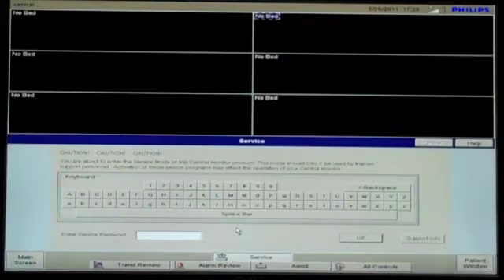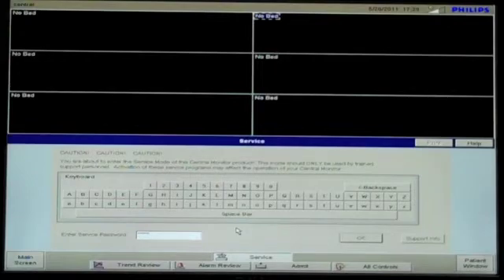Enter the password, M3150, the word Philips, or Support User, and hit Enter.